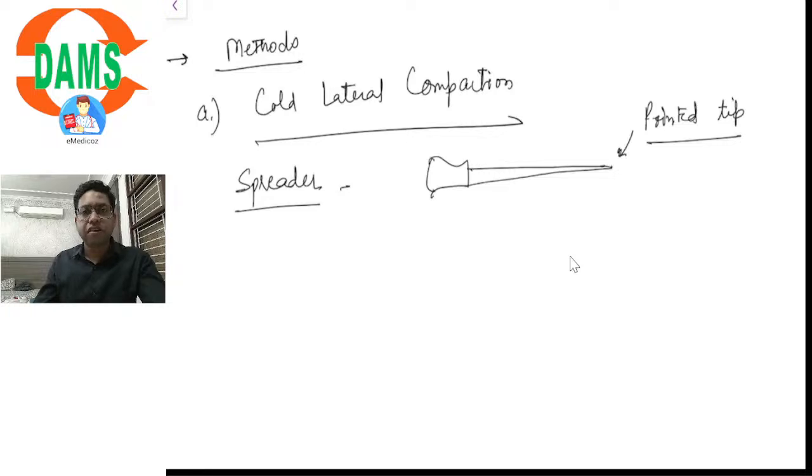It follows the same color coding, same ISO specifications as we have already seen for the endodontic instruments. So whenever I take the sessions, you must know that I take them in a chronological or sequential manner. So whatever knowledge you have gained in the previous sessions is useful in the forthcoming and the current sessions. If you follow this sequence, it would be covering my subject in a chronological manner from the earliest to the latest.